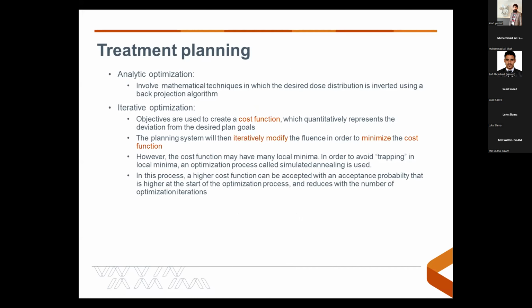There are multiple different methods of optimization. Analytical optimization is similar to a reverse CT.